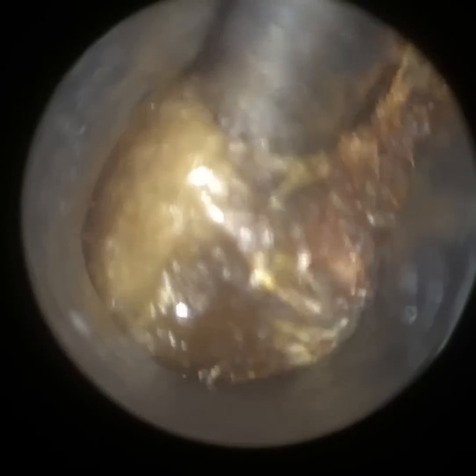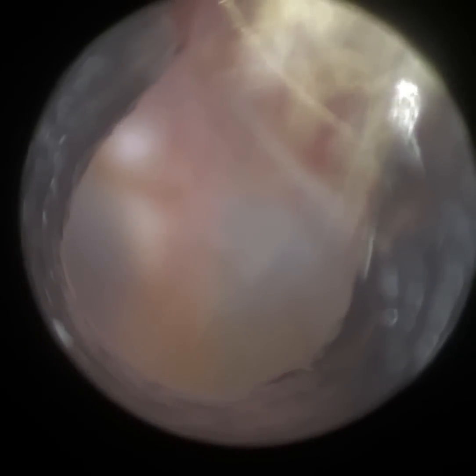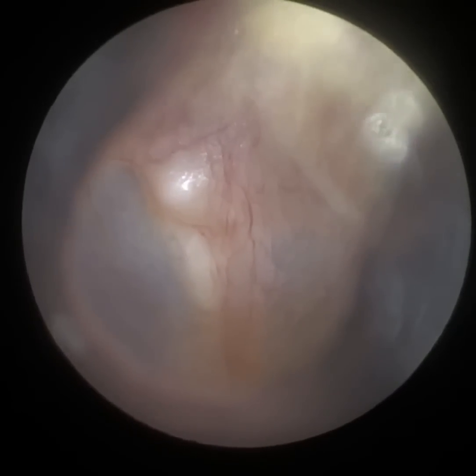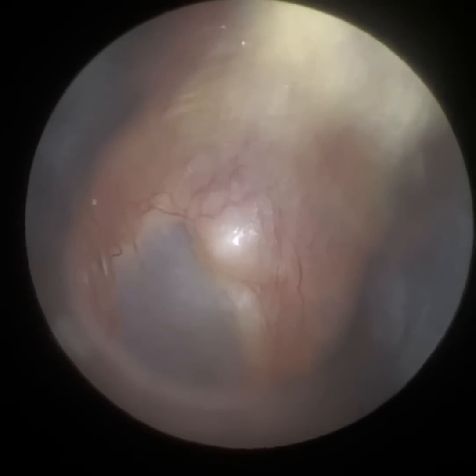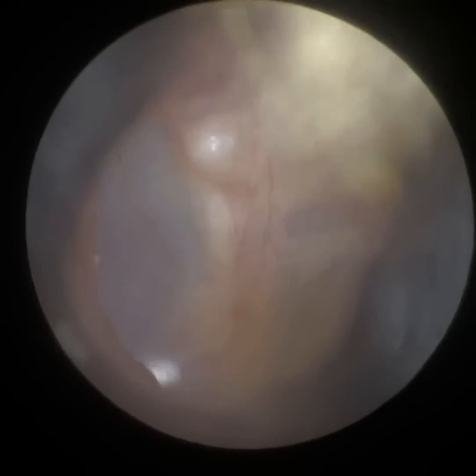You'll have to find it under the Wax Whisperer. With that one, I used the EyeClearScope and that patient also had a probable canal cholesteatoma — that's two potential canal cholesteatomas in a day. As you can see, I've managed to remove that large wax plug. We've got great magnification of this patient's left eardrum. That's the short process of the malleus. We can see all the blood vessels — nice and clear.